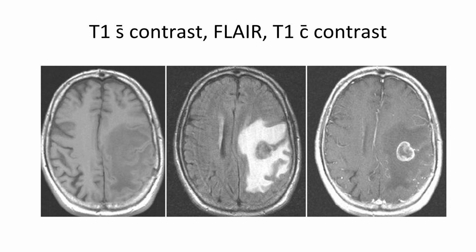And now to jump to MRI, I'm actually going to go to a pretty confusing image, because this is actually an old image taken from one of my old textbooks. This is when MRI was just being introduced clinically in the 1980s. And you can see here the skull actually looks quite white, which is unusual for MRI. Normally the skull is going to not show up much at all. It'll be very dark. And so here it's actually showing up white. So this is confusing because it almost looks like a CT scan.